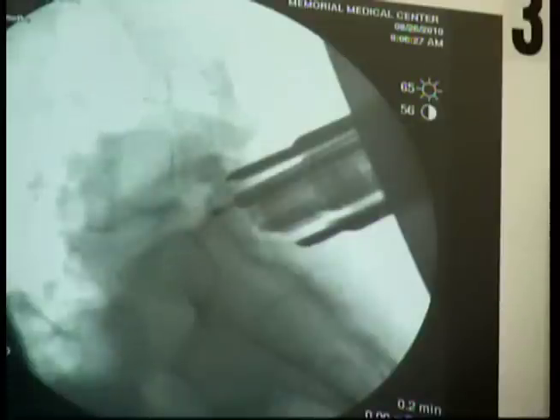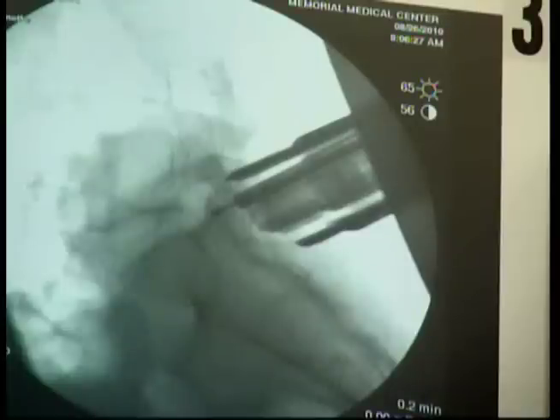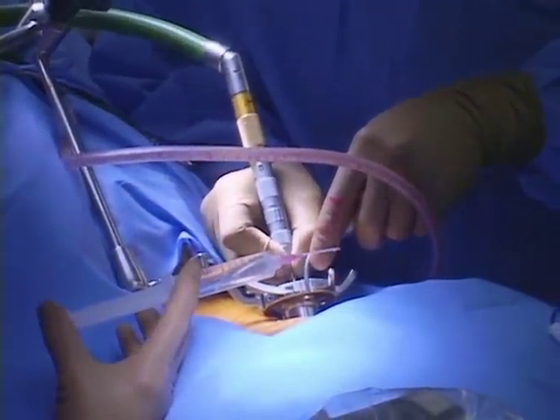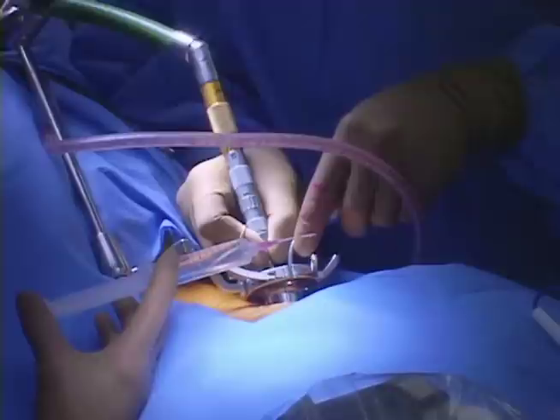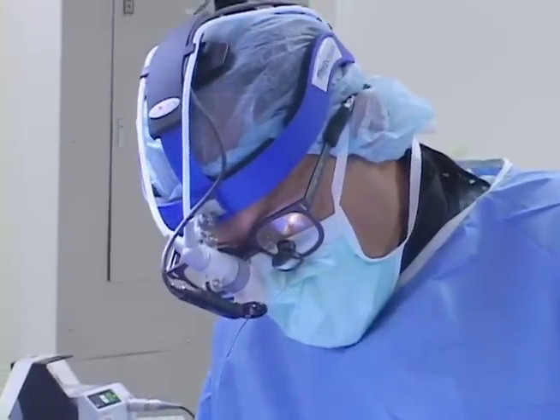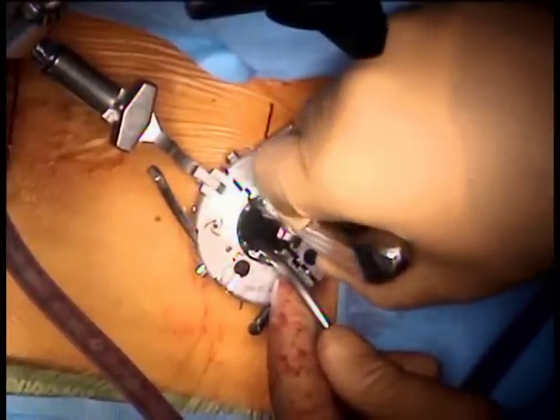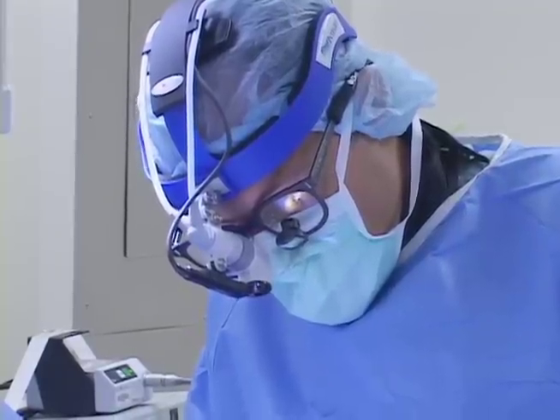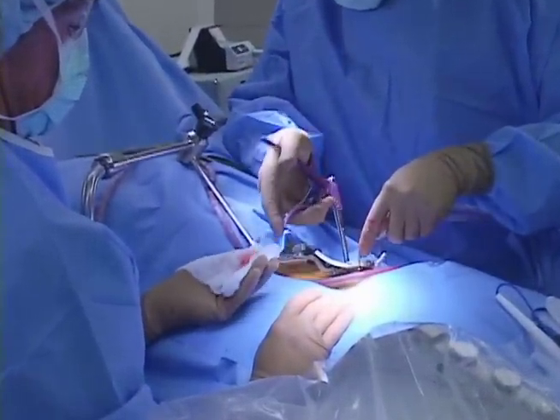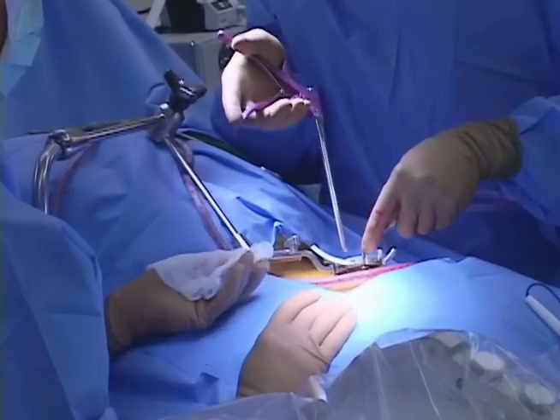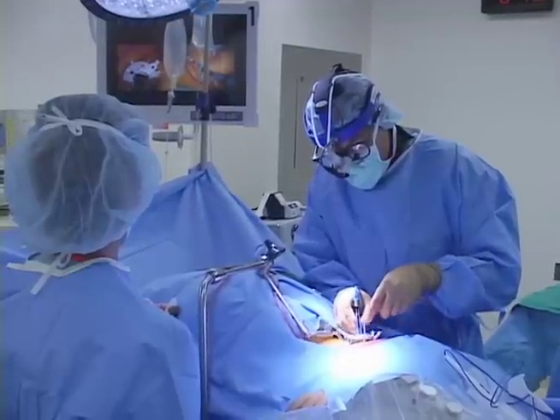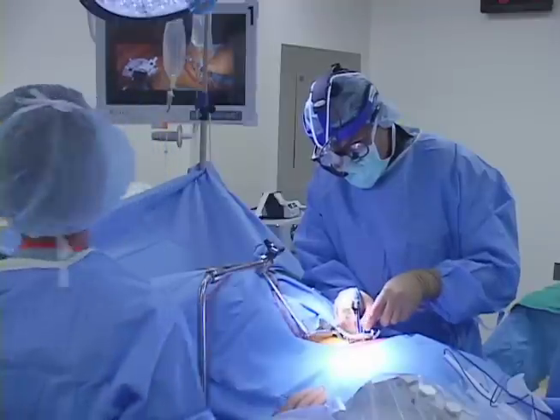We'll take an x-ray here. I've adjusted the burr tip and now we're directing centrally into the disc space. I'm seeing some bleeding at the very bottom, which means I've gone through the facet joint and am getting bleeding from the perineural fat. I'll place a curette down into the area and feel for the pedicle — that gives me my inferior edge in terms of how far down I want to go. I've removed all of the bone laterally and we can see the perineural fat; the disc space will be in view after we bovie down some of the adipose tissue.